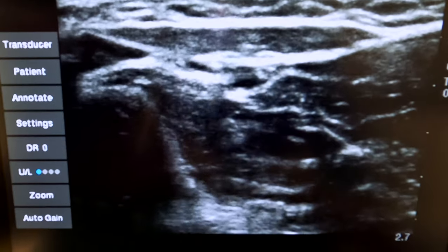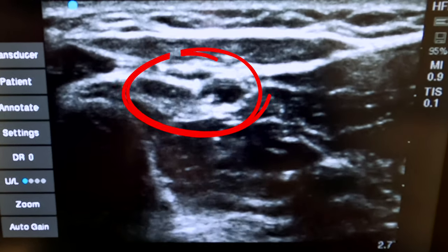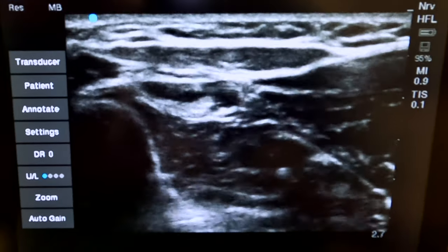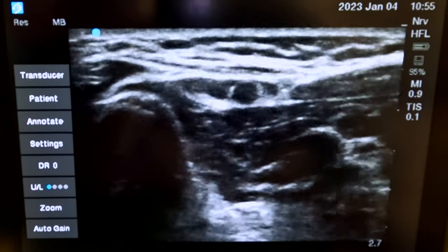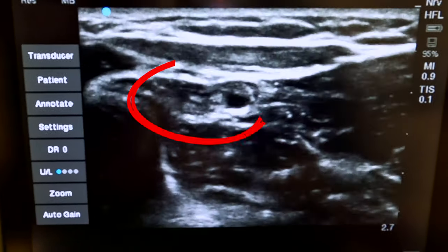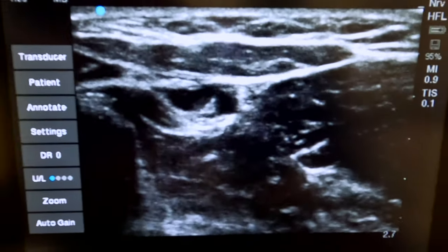A little deeper, next to the artery. That's a nice distribution and a lift of the nerve — let's gain a little more around the nerve. The nerve is basically swimming in that pool of local anesthetic. Very nice image of the nerve.